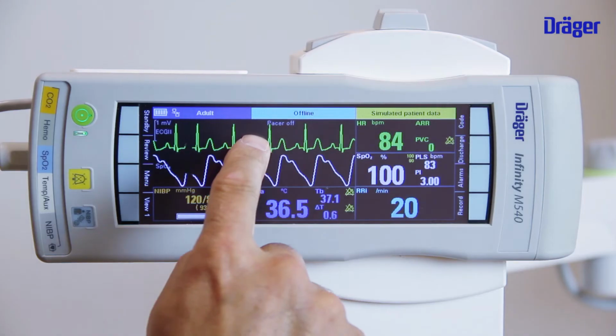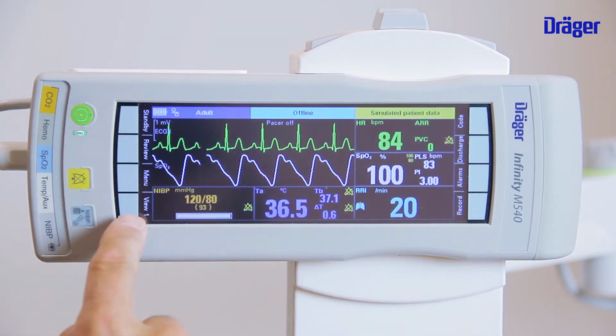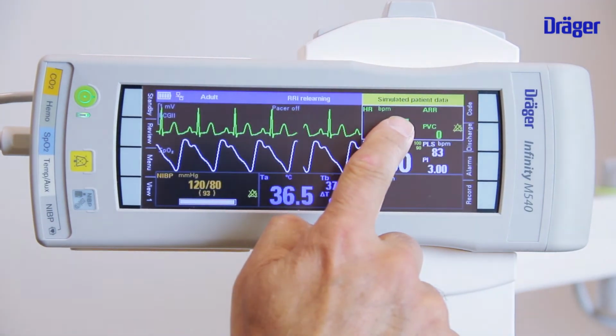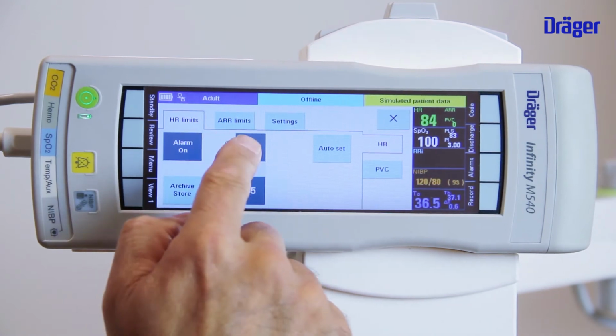When you take a closer look at the touchscreen, you see different boxes over here. So this is a waveform box. This is a parameter box, and then you have on the left side and on the right side different keys. They're called function keys. And 4 of those function keys are fixed and 4 of them are configurable. When you touch the parameter box, there is a new menu that will be opened in your monitor. In here you can change the settings of that particular parameter.